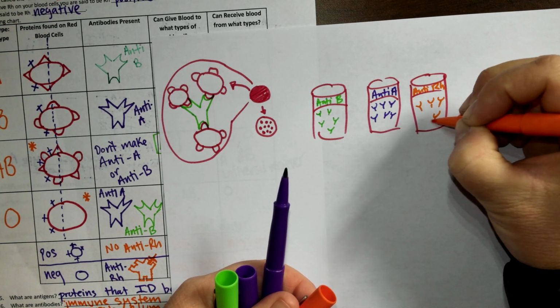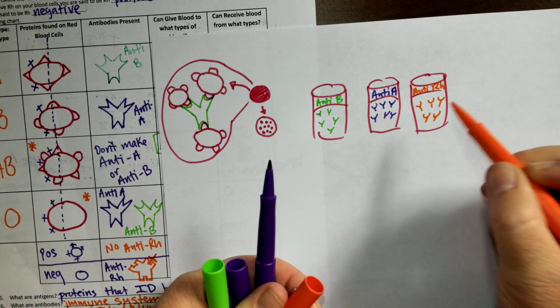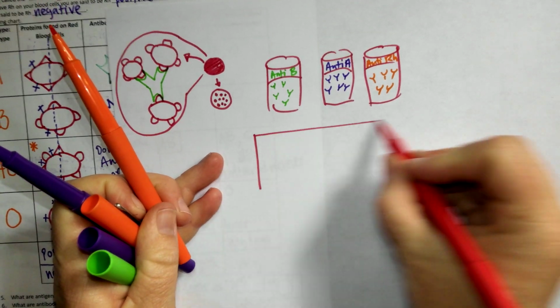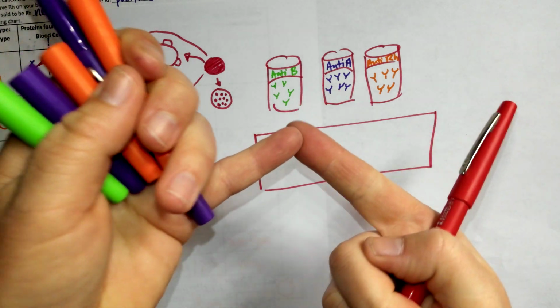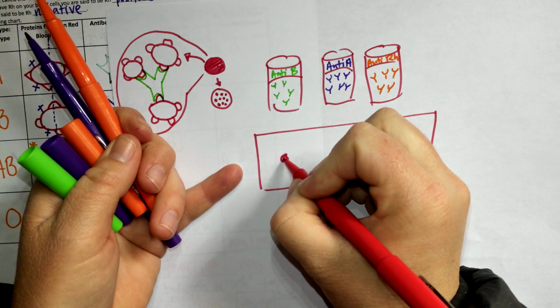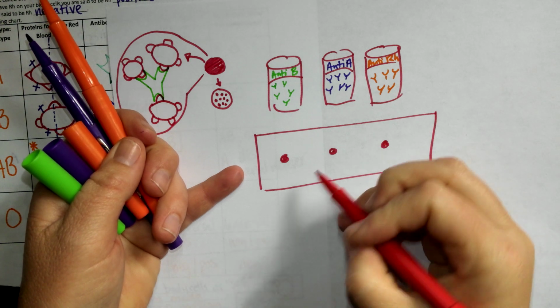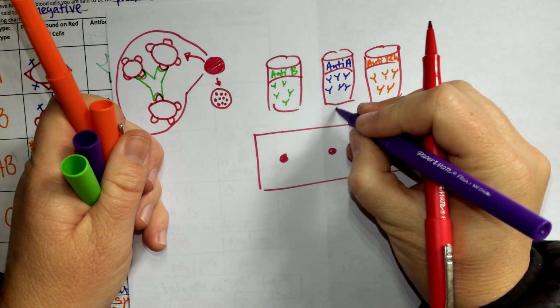Now, I want you guys to know about this because if you have a vial of anti-B and anti-A and anti-RH, and you add it to 3 drops of somebody's blood, like this, I take a glass microscope slide and I prick somebody's finger with a small needle and you squeeze blood onto the slide. I'm going to put 1 drop here, 1 drop here, and 1 drop here. I'll do it in alphabetical order.